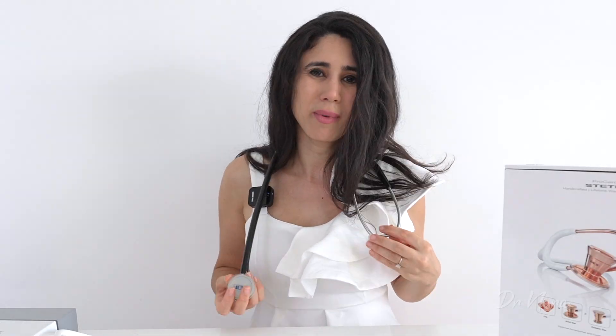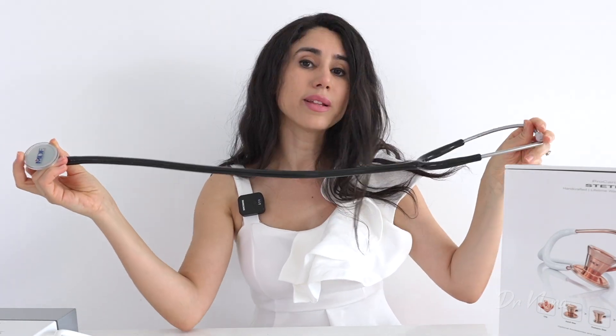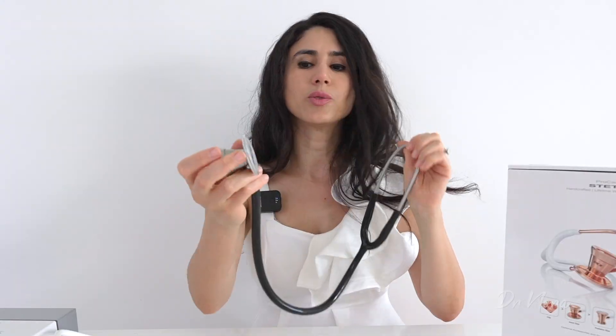It does feel a bit weightier on the chest piece side, so if you're walking through corridors or on ward rounds it might start to slip down — though that happens with all stethoscopes really. In terms of length, it is a little longer than the average stethoscope, which isn't a bad thing, as it gives you some personal space from the patient.